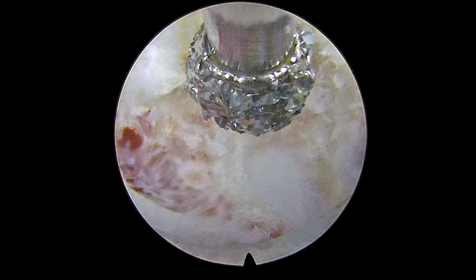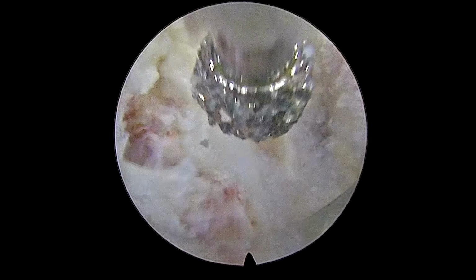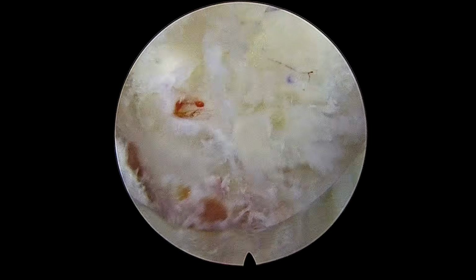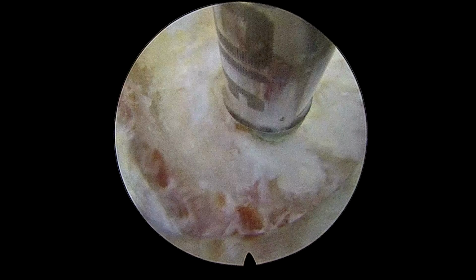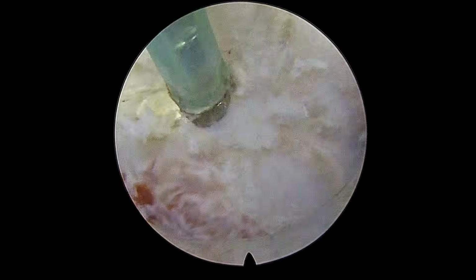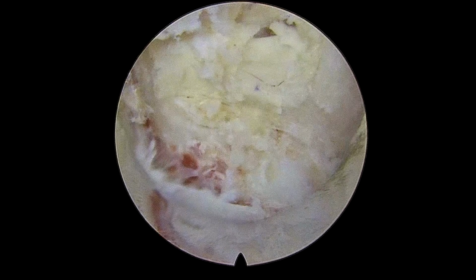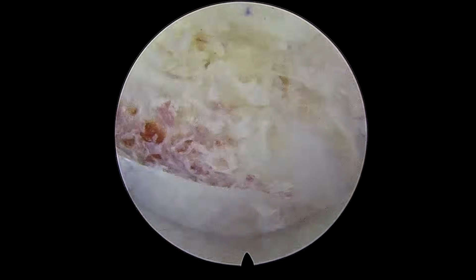Now I'm thinning out the superior lamina as well as the IAP, the middle portion of the IAP. Now you can see here the superior articular process is already exposed. Once we complete our bony work at the superior lamina and the inferior articular process, we'll move towards the inferior lamina. So we have thinned out the superior lamina and the medial portion of the inferior articular process here. We'll now start burring the inferior lamina.